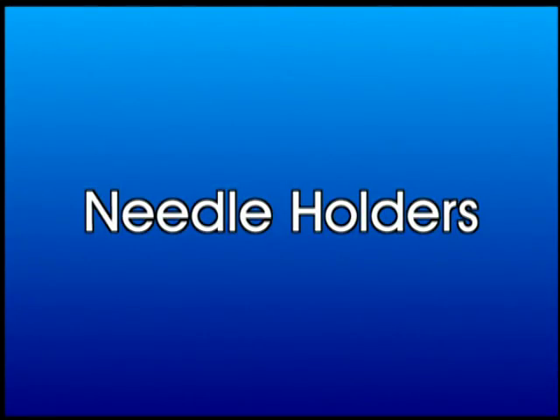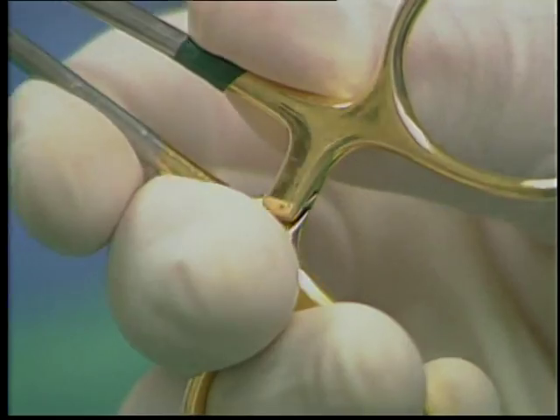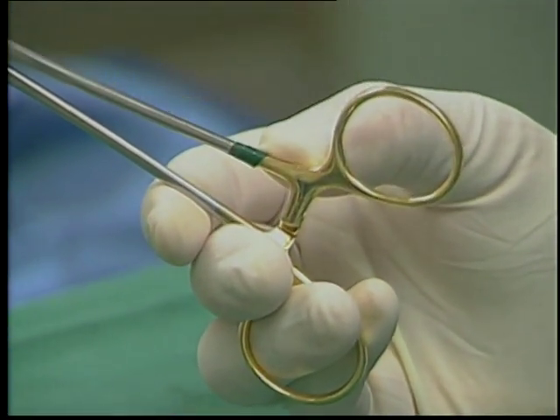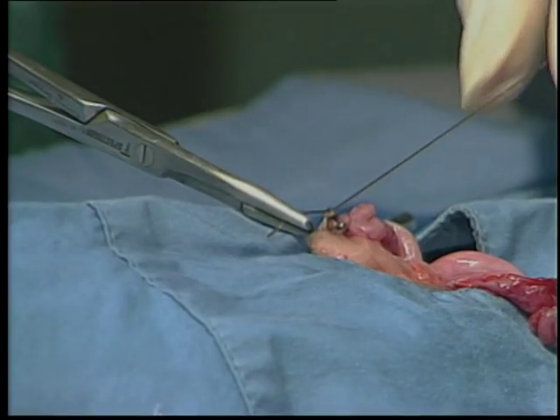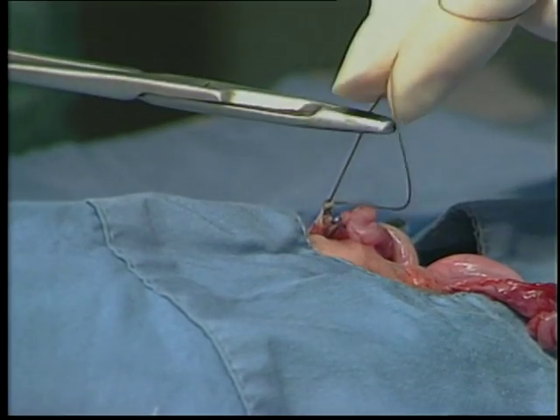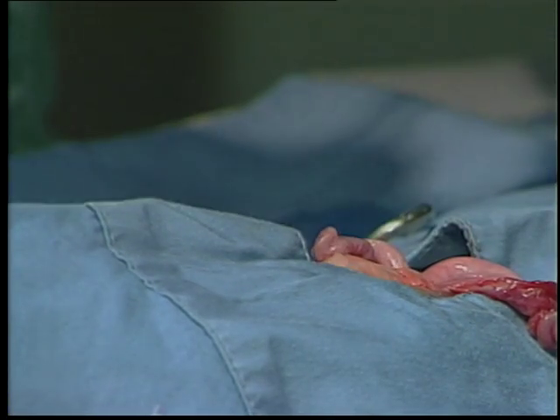The needle holder's primary function is to grasp the suture needle while suturing tissue. Note the box lock feature in the handle that maintains the instrument in a closed position. To release the instrument's grip, squeeze the 2 handles together while offsetting the locking mechanism. Notice how this particular pair of needle holders possesses a pair of scissors adjacent to the gripping surface. This allows the surgeon to cut the suture without having to pick up a pair of scissors.